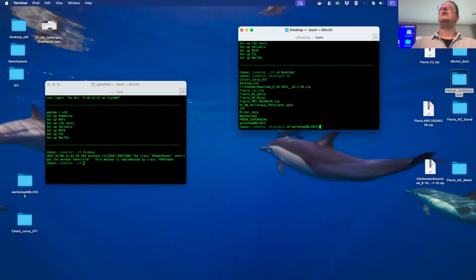Yeah, sorry, I didn't understand. Yeah, I mean, I don't remember. You need to do dissection with TrackVis. I mean, there are some tools to do automatic dissection. With MegaTrack, it could be a possibility to accelerate the dissection manually, but that is the thing.